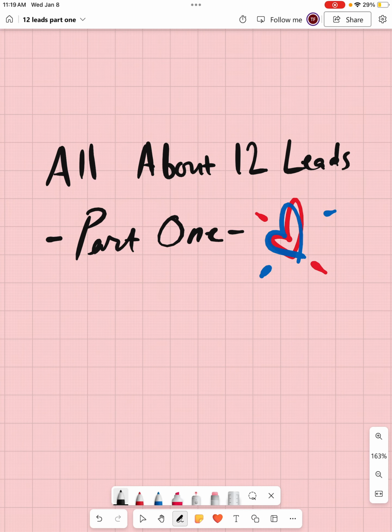Today we are starting our 12 lead series titled All About 12 Leads. This is part one. It is going to be geared towards everybody. So EMR, EMT Basic, Advanced EMT, Paramedic. This is for everybody. For some, it might be some review. For others, this might be information you've heard for the first time, or maybe it was something you heard, but it was a while ago. It'll be good to go over it.